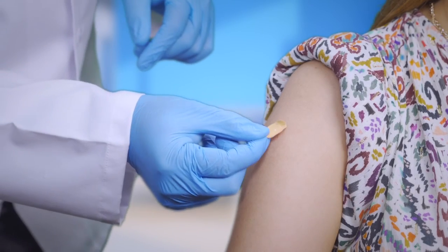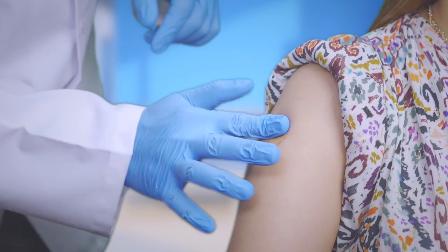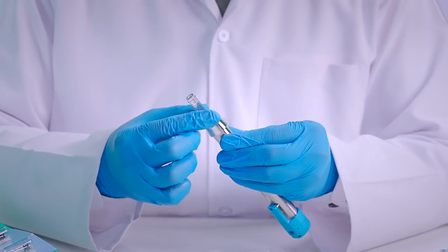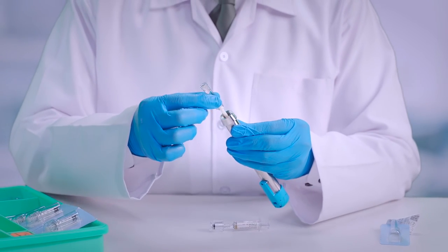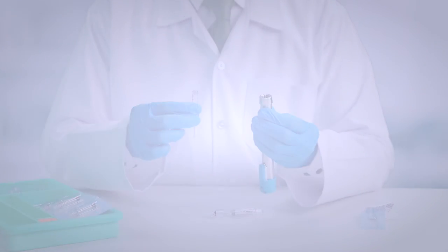Apply an adhesive bandage at the injection site. Twist the cartridge counter clockwise and discard the disposables appropriately.